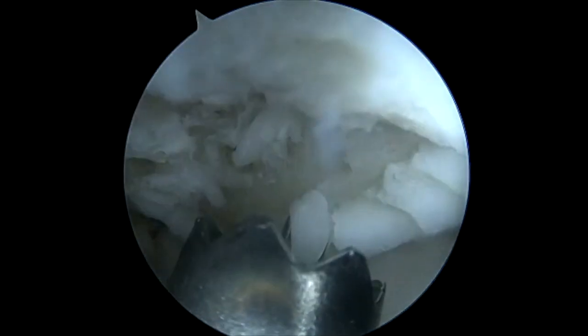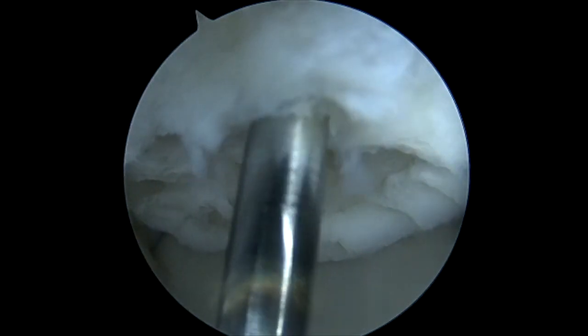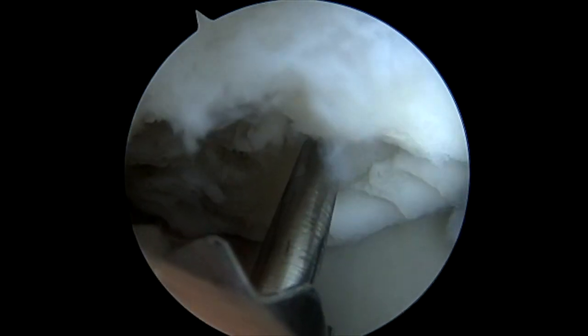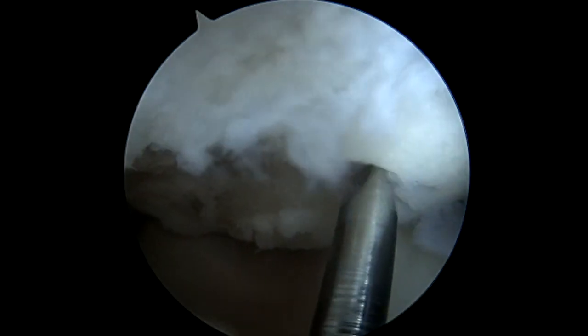We use this soft tissue protector: one, to prevent soft tissues from tethering, and two, it allows us to have a better angle to place these K wires for the microfracture of the base. Not shown here, the tourniquet was released and demonstrated good marrow extravasation, which will eventually turn into the fibrocartilage we've discussed.